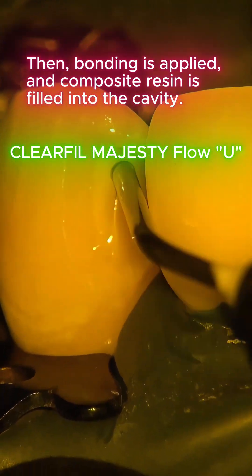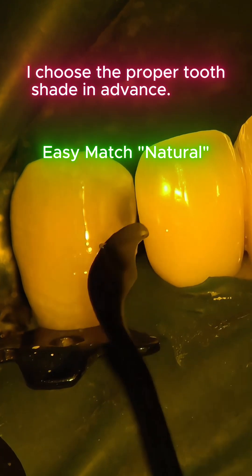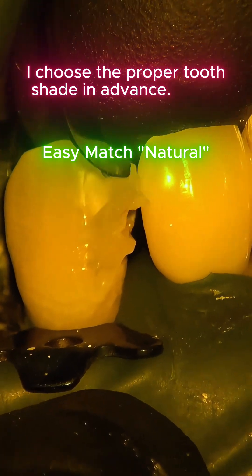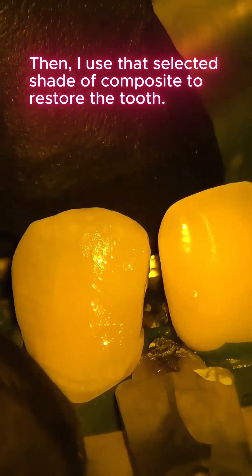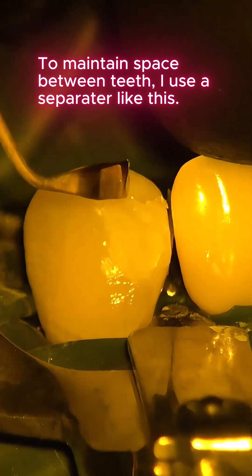Composite resin is filled into the cavity. Before filling, I pre-select the correct shade for the tooth, then use that selected shade of composite to restore the tooth. To maintain space between teeth, I use a separator.